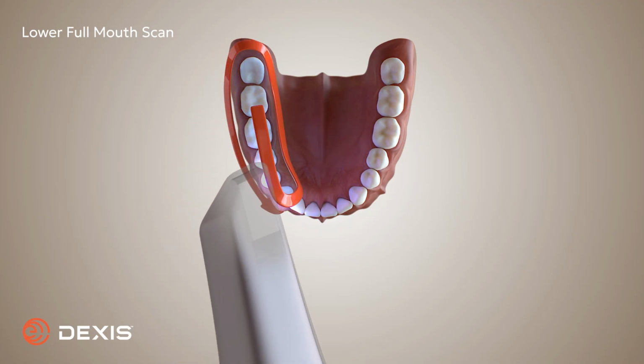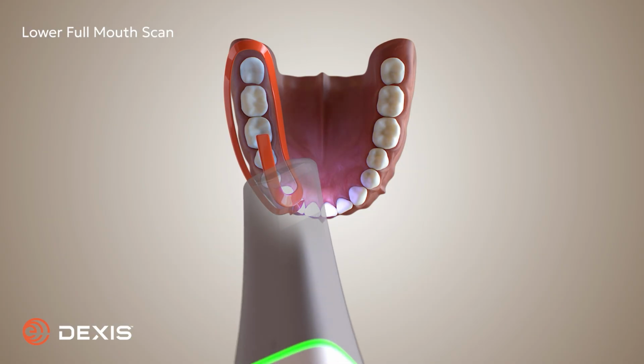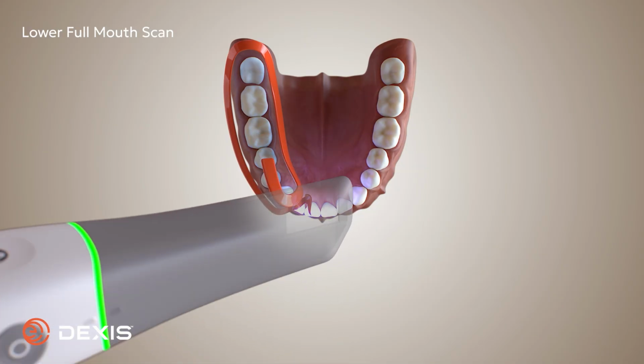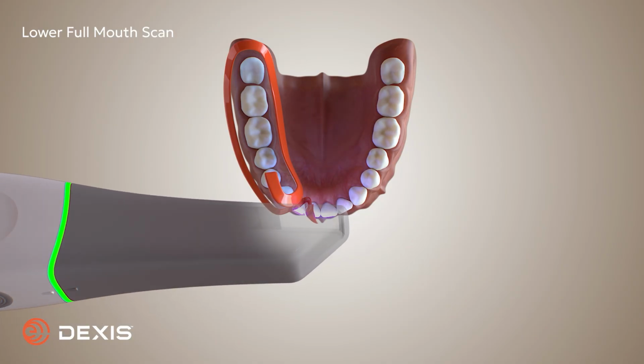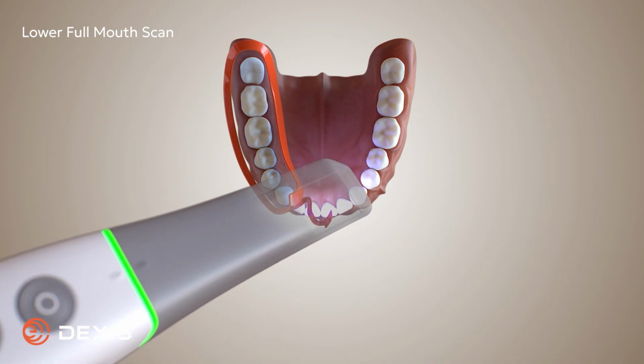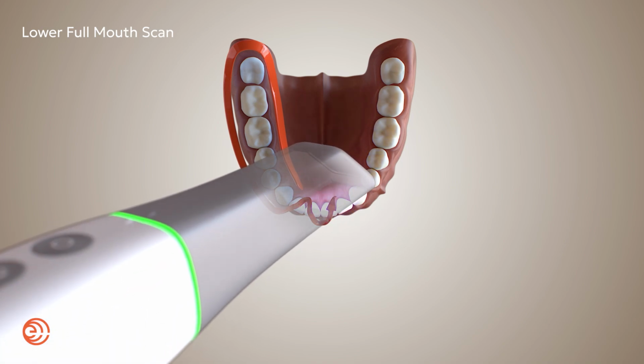At the canine, transition from facial over the incisal to the lingual. Slide to the lateral and repeat. Lingual over the incisal to the facial. Continue this anterior zigzag pattern until all front teeth are scanned.